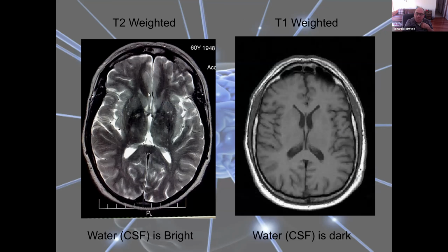Now we're talking about MRI. We know that MRI doesn't use radiation. So as far as utilization, as far as imaging goes, it's very safe. We can scan anybody, get them off the bus stop, bring them in and do a scan. There's no radiation. It's all manipulation. In clinical practice, it's manipulation of hydrogen protons.